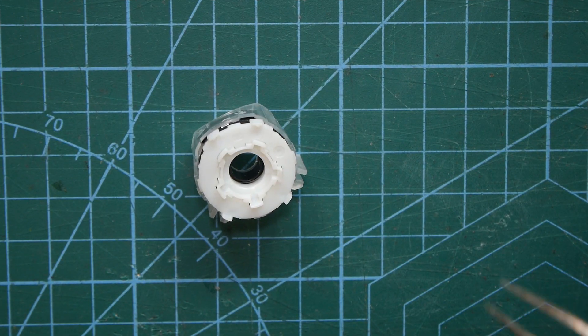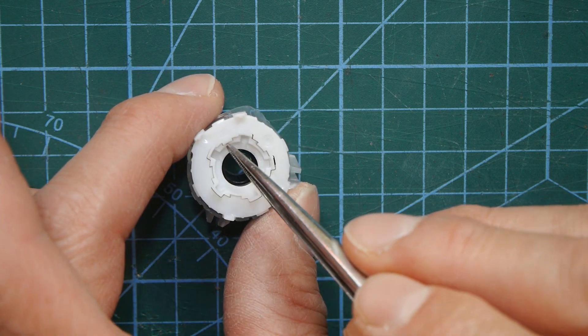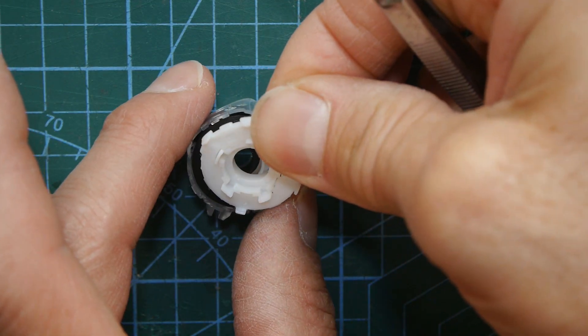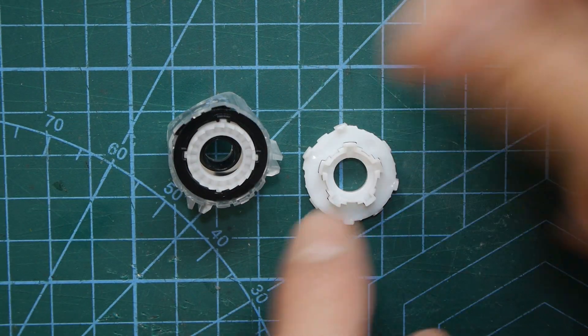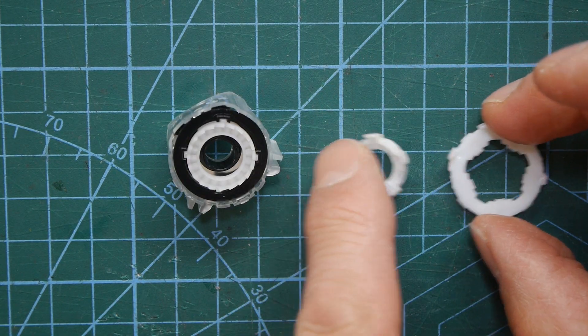So the first bit to come out is these white parts and it's actually two bits. I'll take the top one off. There it is and there's another one underneath it so those two key together and I'll explain what they do in a minute.